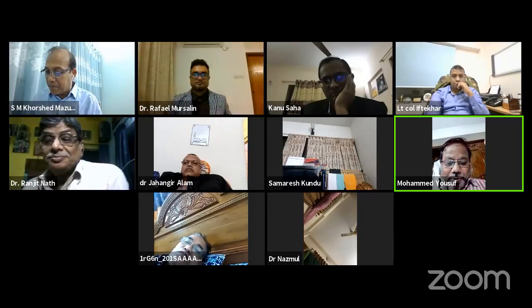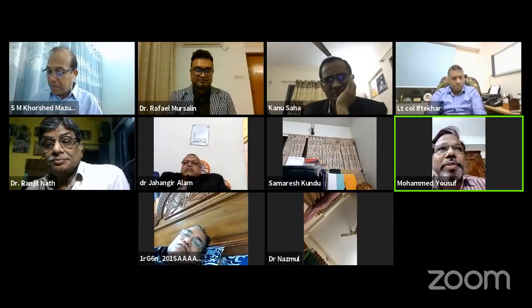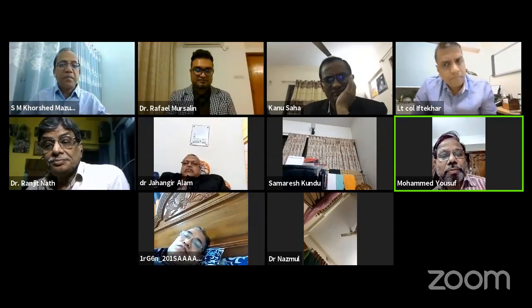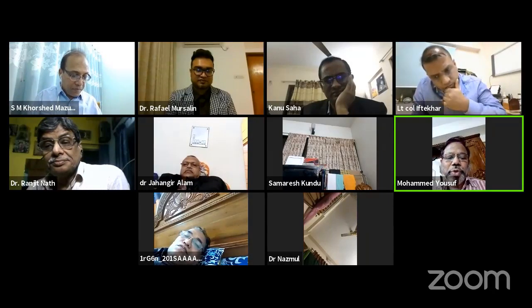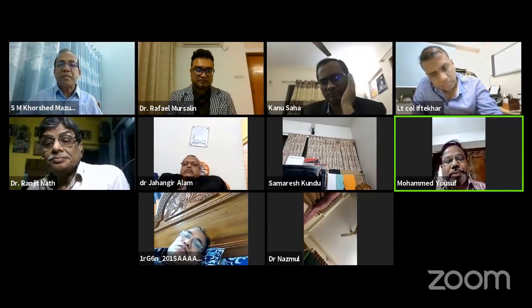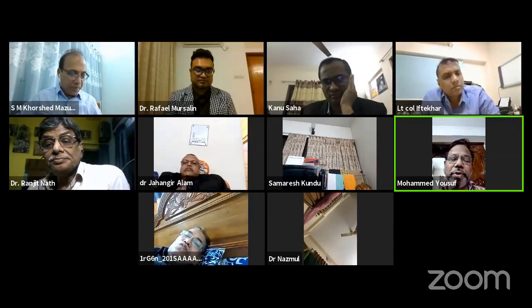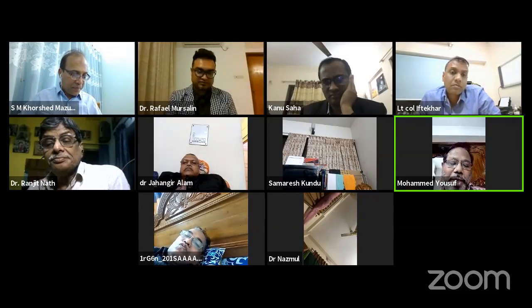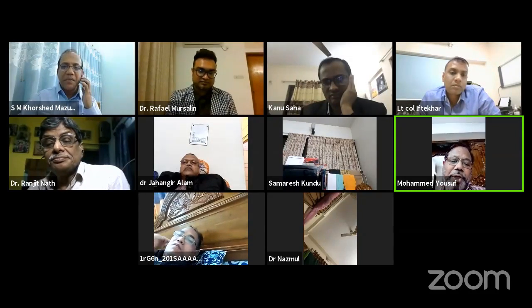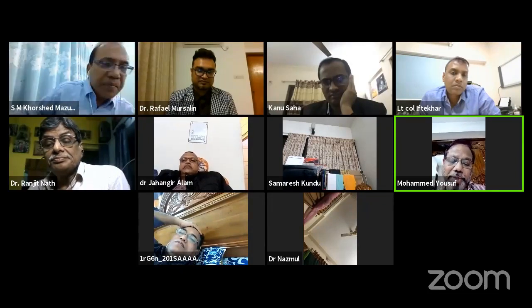Thank you very much for giving me the chance. I would like to say a few words to the junior colleagues. Number one, CT, MRI, or both is required, especially for carcinoma of the head and neck region, to see the extension and involvement, and to get the staging and planning of management. Number two, CT scan is better for laryngeal carcinoma, especially in advanced cases, because MRI needs a long time and breath holding is required during the scan. So CT scan is easier for the patient because it takes a short time.